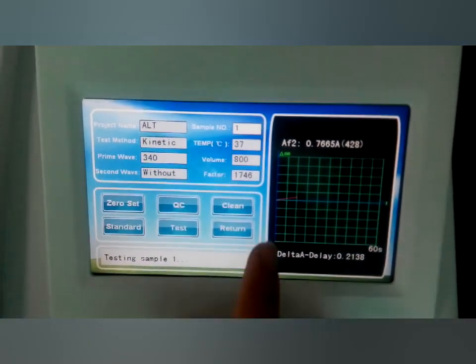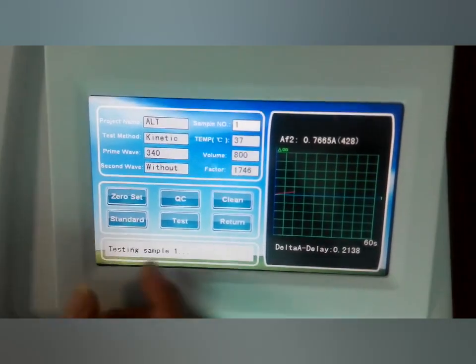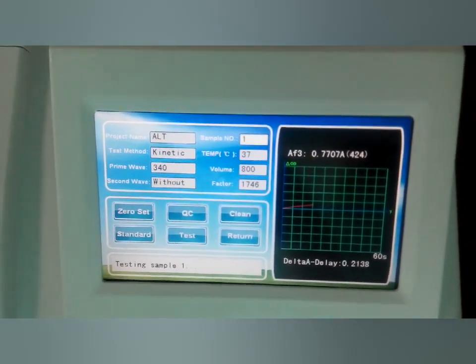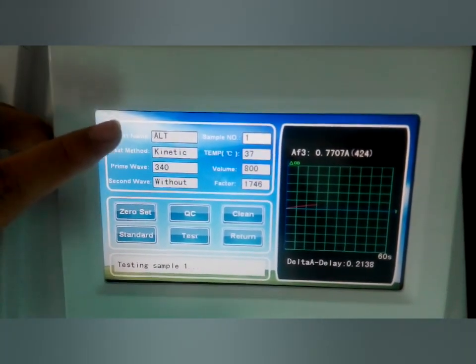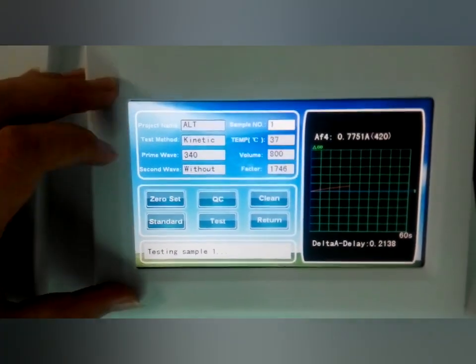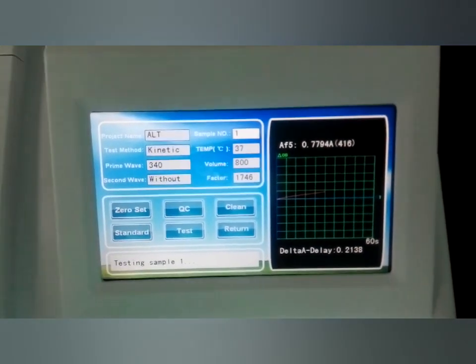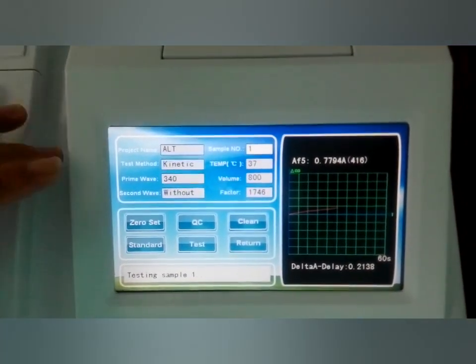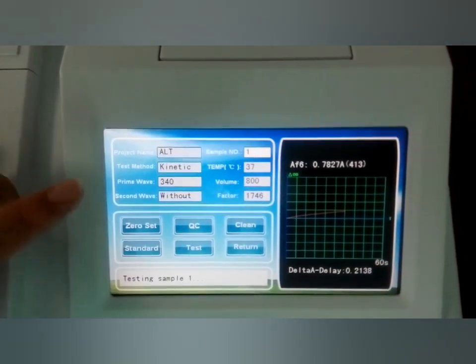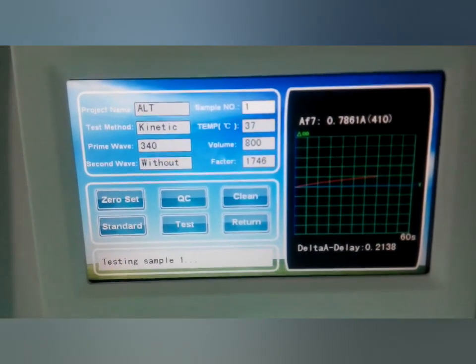Now the result is ready and you can see other options here: standard, return, clean, QC. Because different items have different test ways, some items require us to do the standard and the QC. We just do it according to the reagent menu and do the standard or the QC — it is all according to the item's reagent menu.